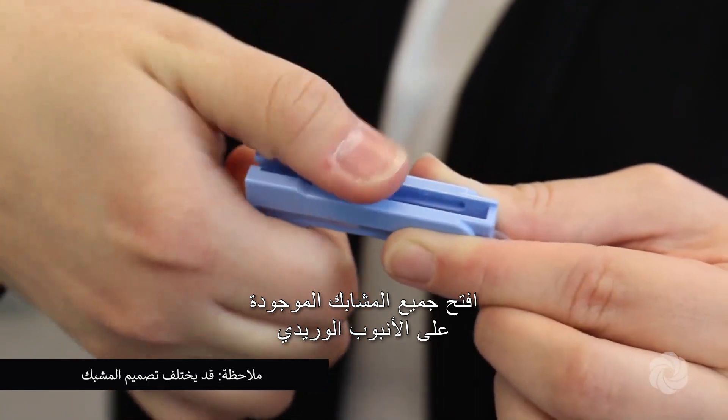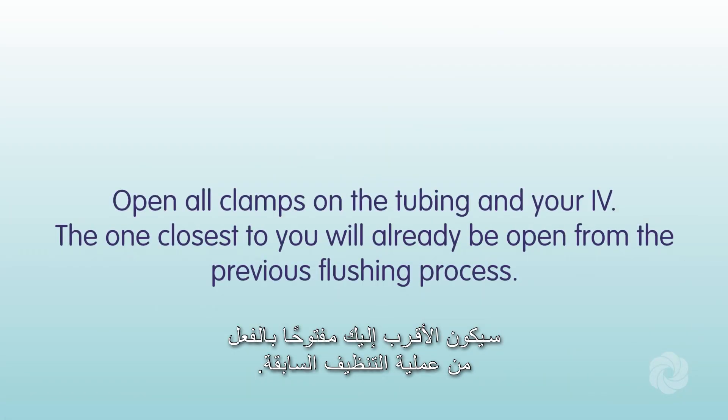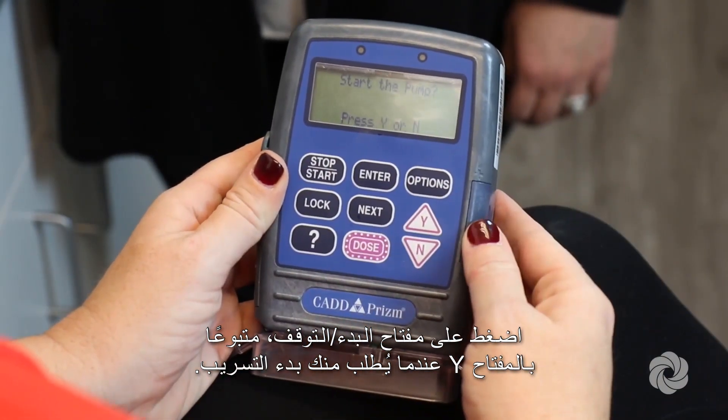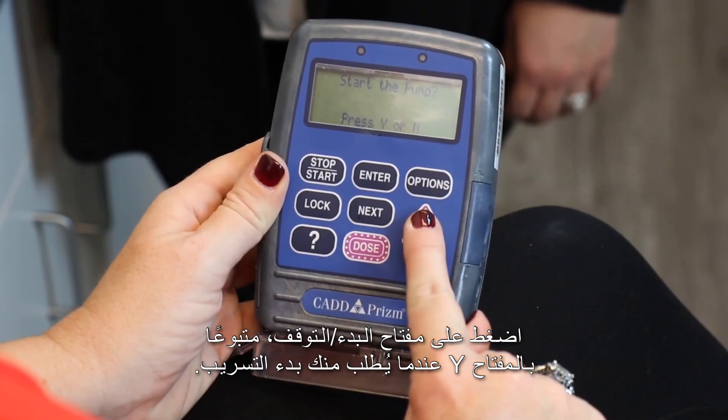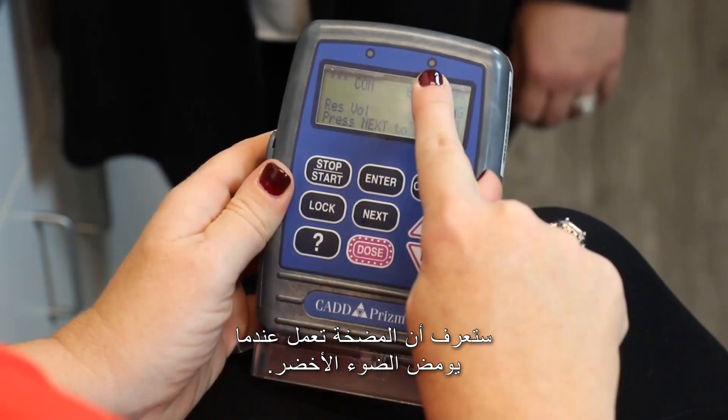Open all clamps on the IV tubing. The one closest to you will already be open from the previous flushing process. Press the start-stop key, followed by the Y key when prompted, to begin the infusion. You will know the pump is running when the green light is blinking.